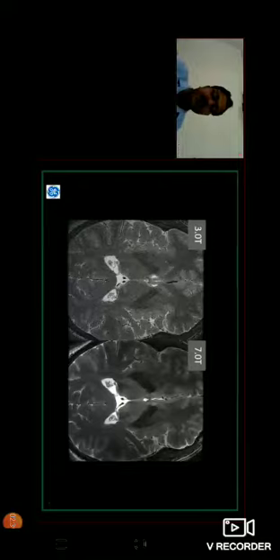We'll see all these parameters one by one. First we'll talk about the SNR, or the signal to noise ratio. This word you may hear in your daily clinical practice. What is this? Signal to noise ratio. This value influences the quality of the images.